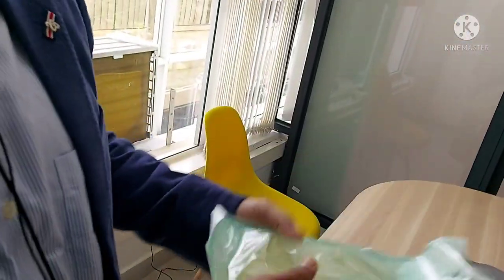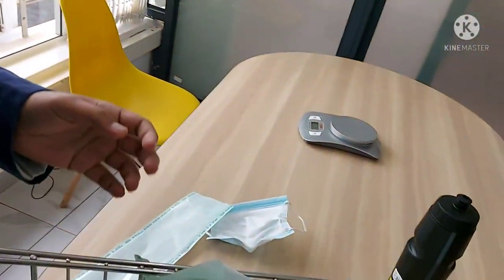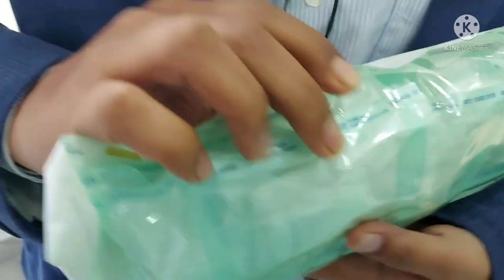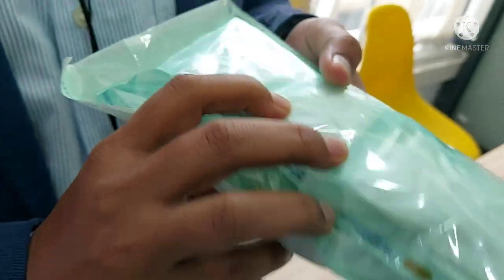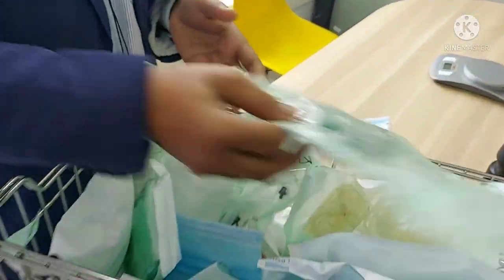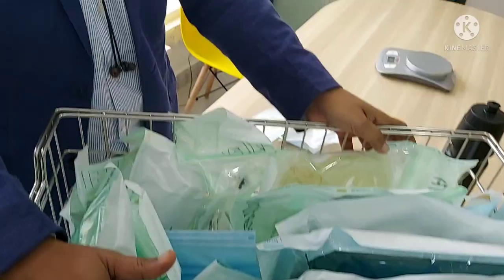Cassette and tubing. These are the vitreotomic cutters, and likewise we have sterilized them. You can see that the color has changed from the initial blue to the cocoa brown, and it shows that it has been fully sterilized. The same is on every pouch. So this is the final product, sterilization.